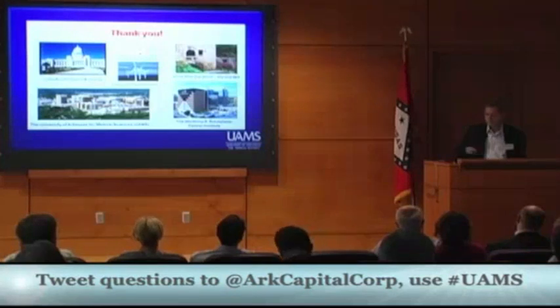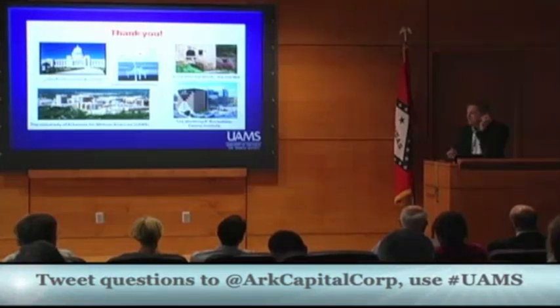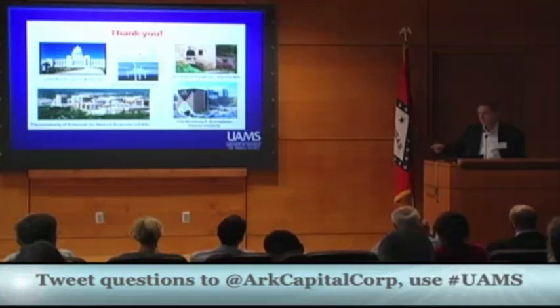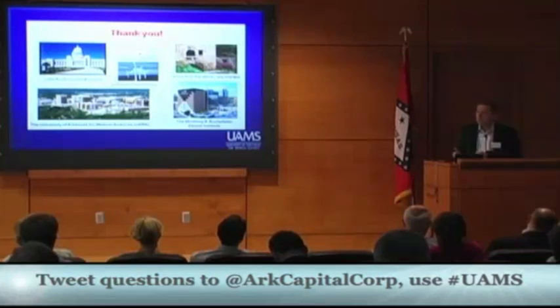For the application of detecting circulating tumor cells for cancer metastasis prognosis, we hope for early screening during mammograms. We analyze women to find the presence of cancer cells in blood, which is probably much earlier than X-ray or other systems can determine. Ours is semi-portable. What does that mean? We have a portable system on the hand and other parts, like ear clips, and right now a little large laser, which is portable but a little big. We have only an experimental small prototype which combines a small laser, ultrasound, etc., and remote control, detection, and analysis. It's huge information, like flow cytometry. It's a very simple device.